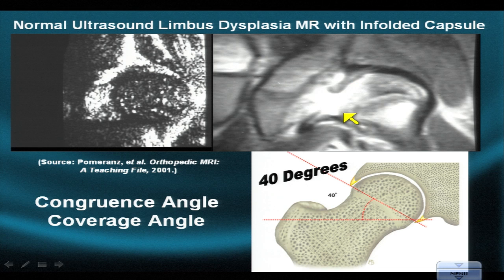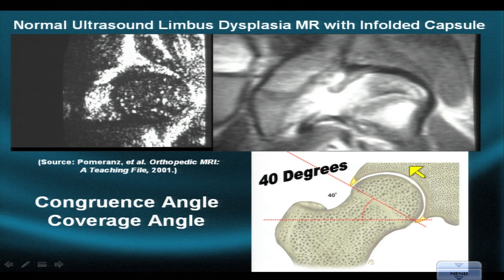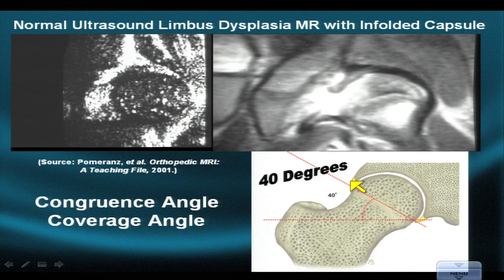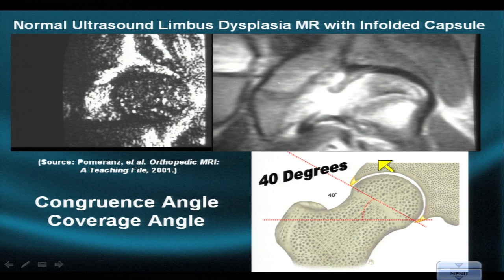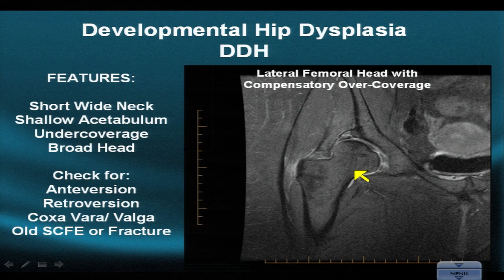MRI provides a lot of useful soft tissue information. One way to assess the conformity, congruence, and coverage of the acetabulum relative to the femur is via the congruence or coverage angle. A horizontal line is drawn perpendicular to the vertical, and a second line is drawn from fibrocartilage rim to fibrocartilage rim. This angle should be about 40 degrees. If the angle is too small there may be over-coverage; if too large, there may be under-coverage.